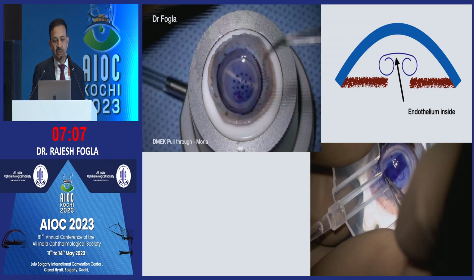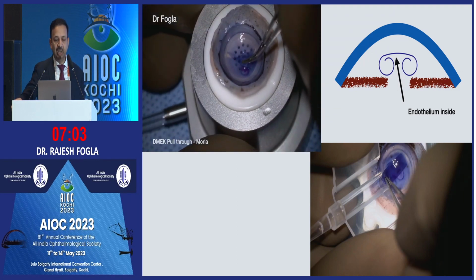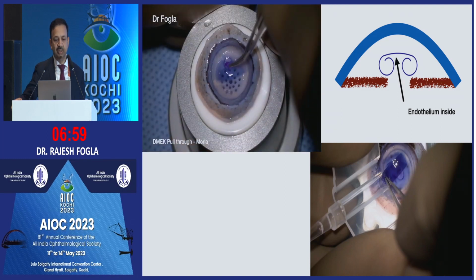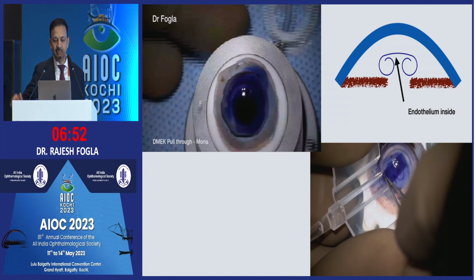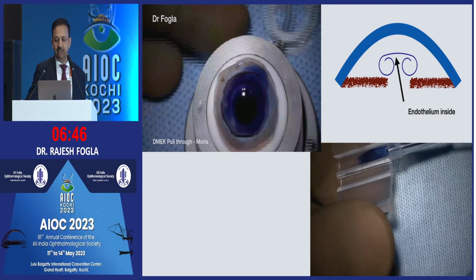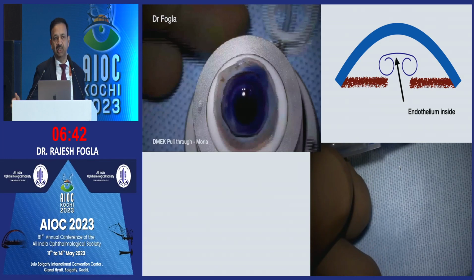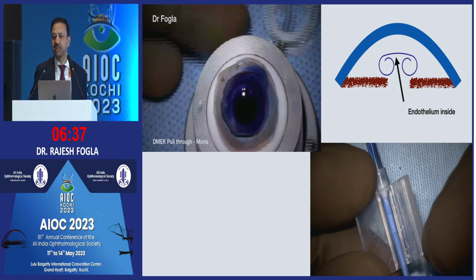You can use the pull-through technique as well. So here you can see that we are stripping our donor DM. We create a trifold, but this is pretty much like folded like a DSEK graft. And once you have folded that, you stain it with trypan blue. And then here I'm using the Sensor cartridge, and the trifolded DM scroll is pulled into the tip of the cartridge. Remember that here it's endothelial inside. So if you touch outside, it's the stromal side, you're not killing endothelial cells.